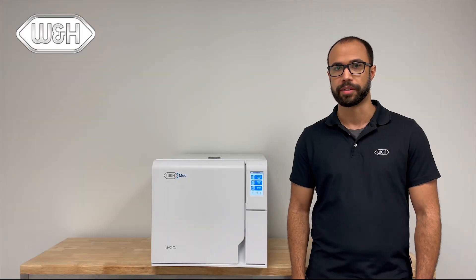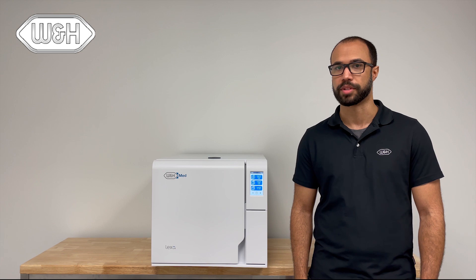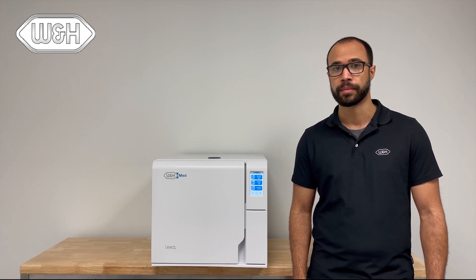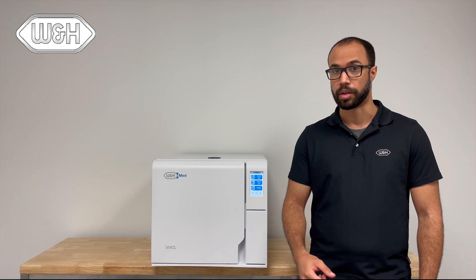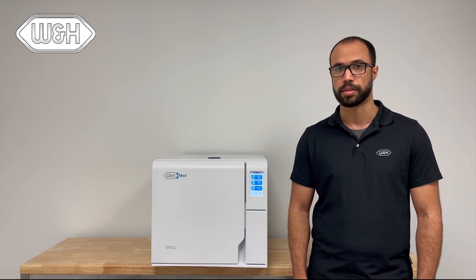Hi, my name is Randy Brown and I'm a repair technician for W&H Impex. Today, I'm going to introduce you to the Lexa Sterilizer. First, I want to show you how to install the Lexa Sterilizer.